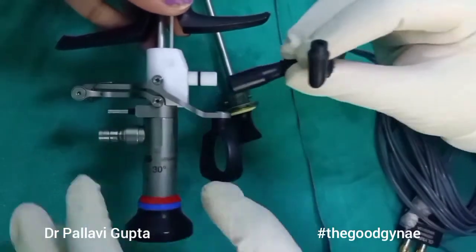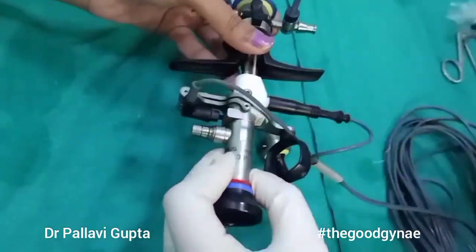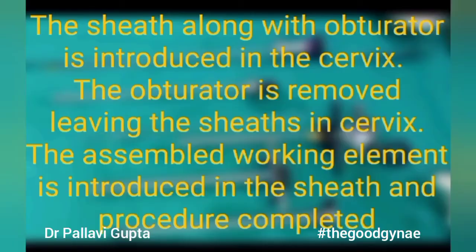Once our resectoscope is checked, we are going to attach the light source, energy source, and distending medium. We introduce the sheaths and the obturator into the cervix, remove the obturator, the working element is introduced, and the procedure is completed.